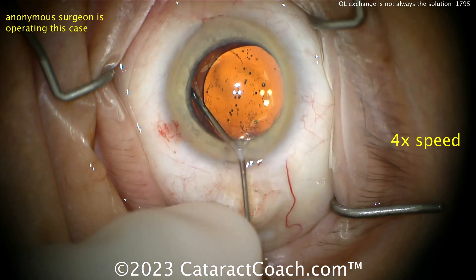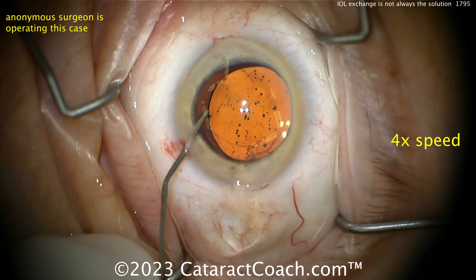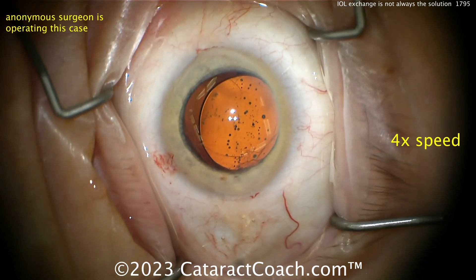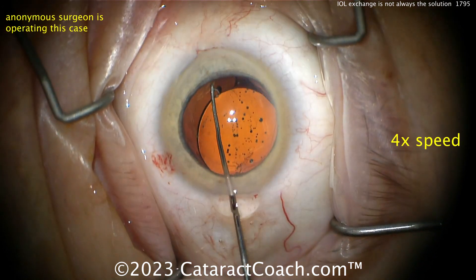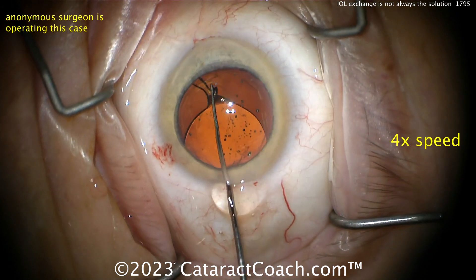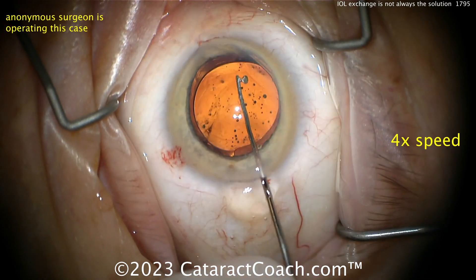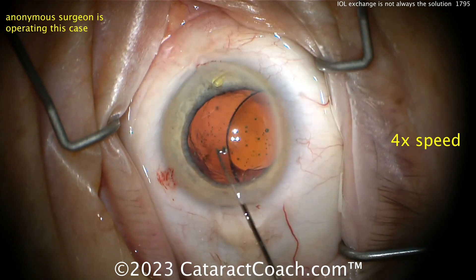More visco dissection — I like viscoelastic, always cheaper than vitreous. Looks like the posterior capsule is intact. Let's get that lens up using some sort of hook here, getting it freed up. Remember that haptics may get stuck in the bag. Nice and gentle — good job, get that lens up.